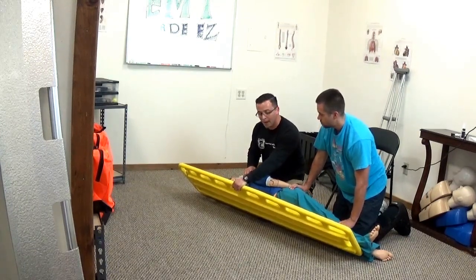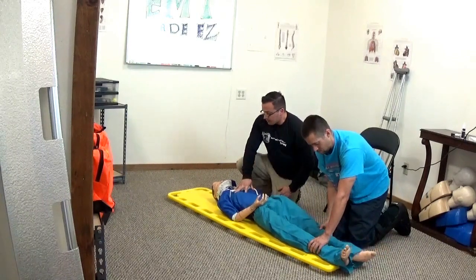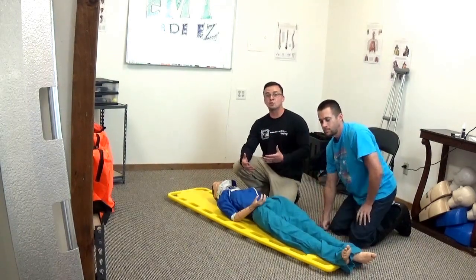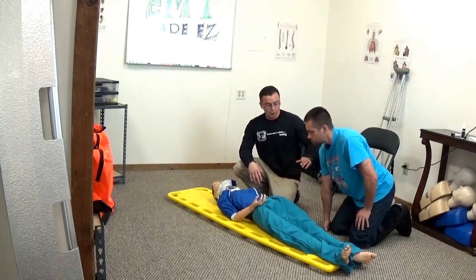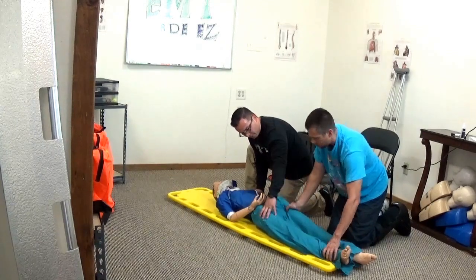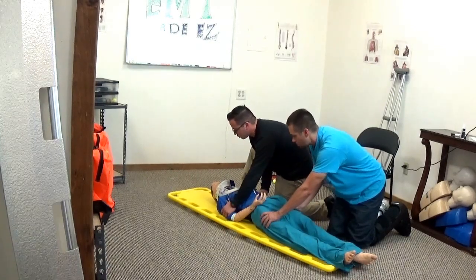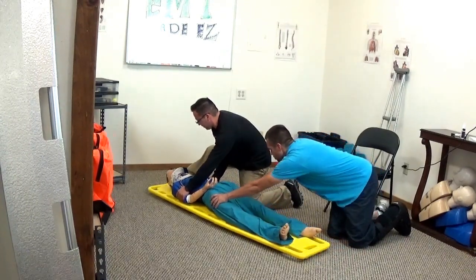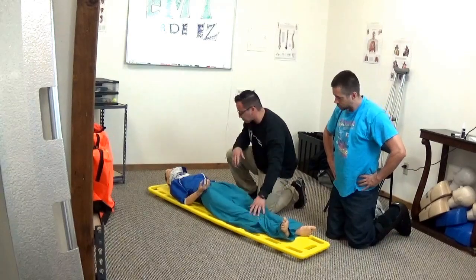On your count, lower the patient back onto the board. Then on your count again, shift and move the patient to their right — always to the patient's right — and up approximately 10 inches. Grab the waist while your partner grabs the shoulders and reposition until the patient looks to be in line. Straighten out the legs as needed.